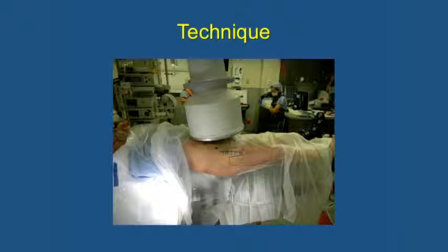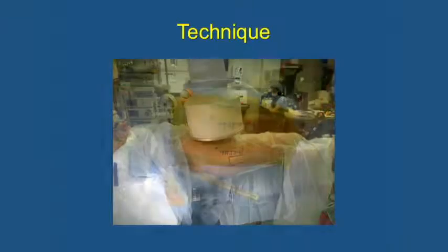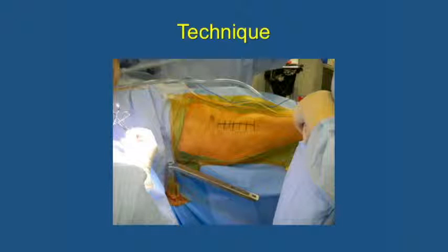the components. I do enough hip replacements that we don't really ever have to change the component position, but I take an x-ray in the operating room, a traditional x-ray, not with that machine, of every hip I do. Every posterior approach hip that I do, I take an x-ray in the operating room because that's the time I can fix something. What good does it do me to do an x-ray of your hip once I've closed your wound and you're in the recovery room? If something needs to be changed, the time to change is before we close your wound. So everybody gets some form of an x-ray in my hands because I think that's good medicine.